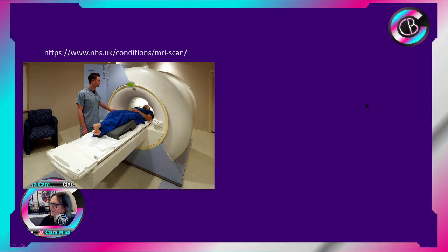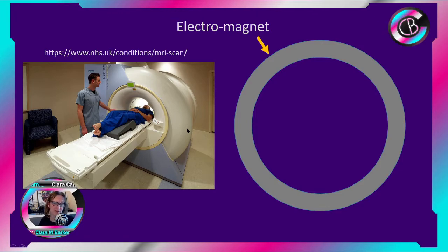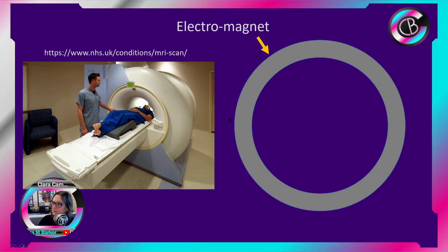Like I say, it's a basic overview. But the main ring, the big outer ring, that's going to be a big old electromagnet. And generally, these are superconductors. This is what we sell most superconductors for. So that is a big old superconducting electromagnet.